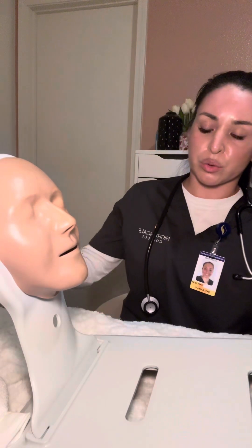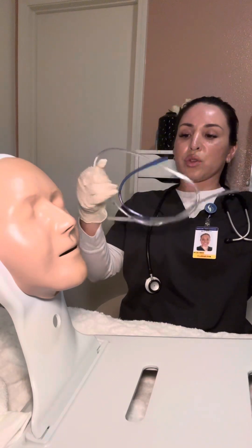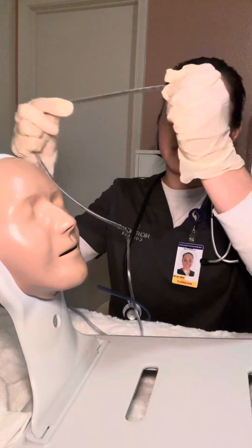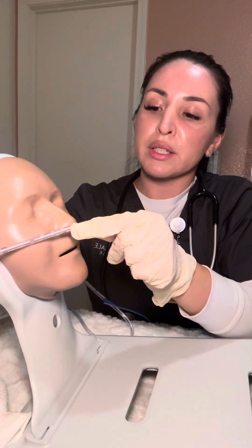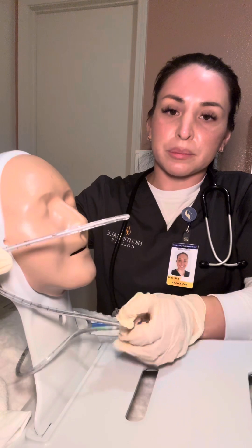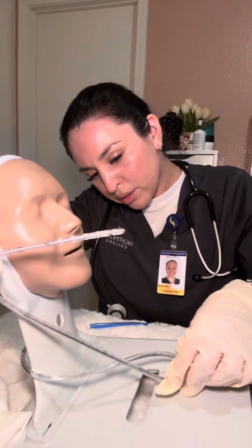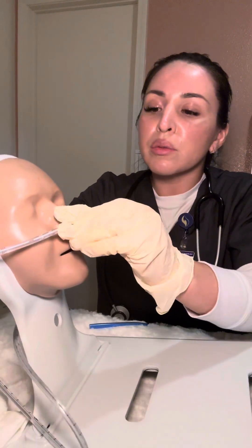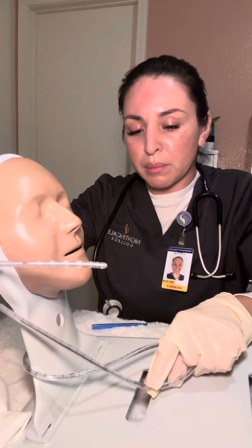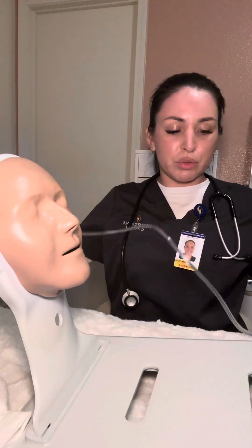Now I'm going to get my tubing ready. I'll grab the tube and measure how far I need to insert it. To do that, I place the tip of the tube at the tip of the nose, then to the tip of the earlobe, and then from the earlobe down to the xiphoid process. Looking at the markings, it looks like we're at about 40 — there's already a marking there so we don't need to mark it. If there weren't, we would just place a piece of tape there.